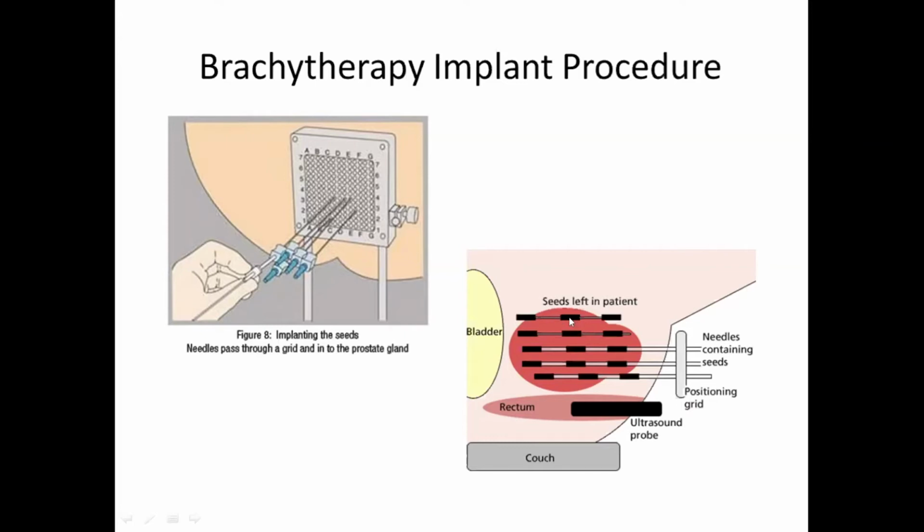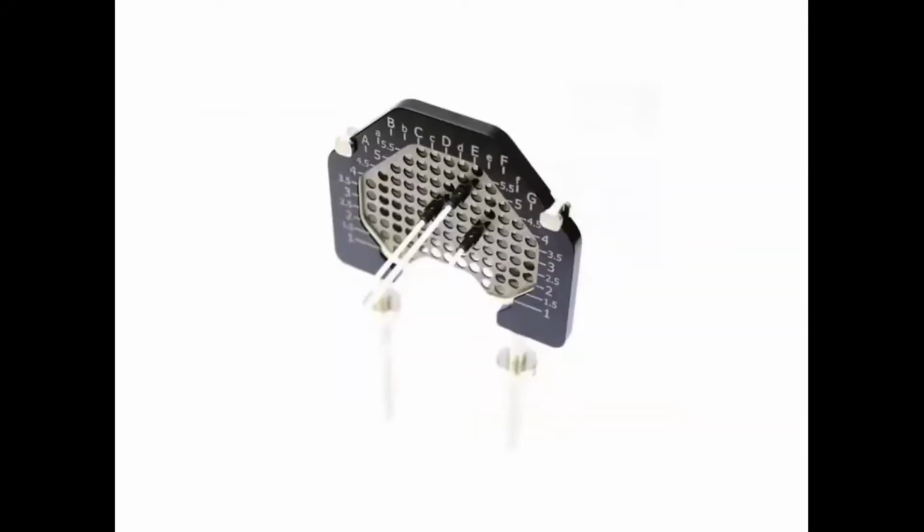That's not the procedure for the high dose rate brachytherapy, where what we're putting in are blind ending plastic tubes. And then they stay in that template, this template that you saw here, and they're locked into place by a clever locking device. The template is then stitched to the perineum, so that the patient wakes up with about 20 plastic tubes through that template, stitched onto the perineum, and they wake up with a catheter in their bladder as well.